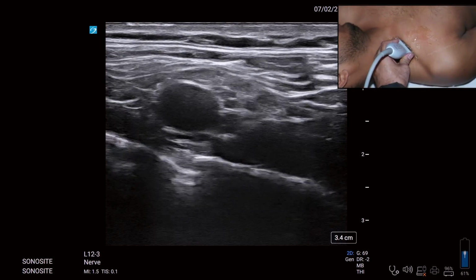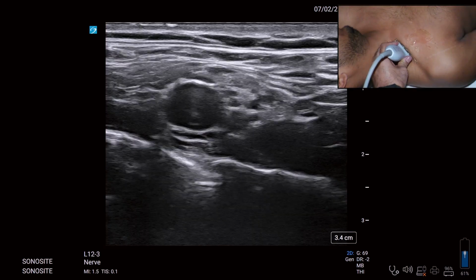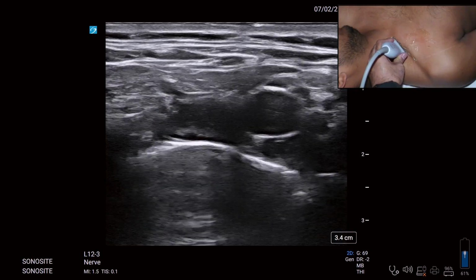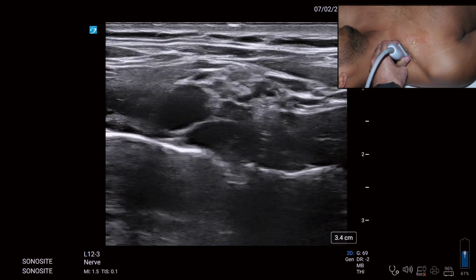This is a linear probe. Left hand of the screen, my dear friends, is medial. So what do I see? The subclavian artery just keep rattling out. So the entire plexus is seen like this. So can I see the shimmery pleura? Can I see the rib? Right now my subclavian artery is resting where?